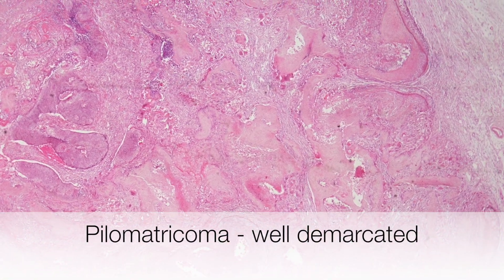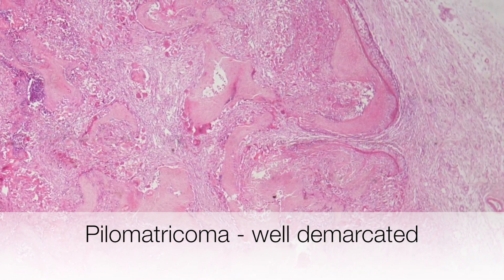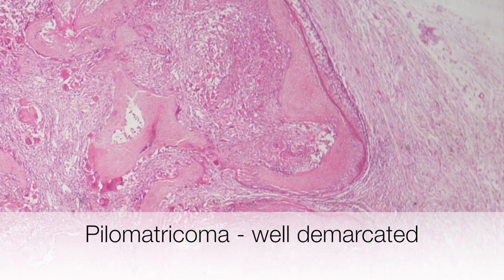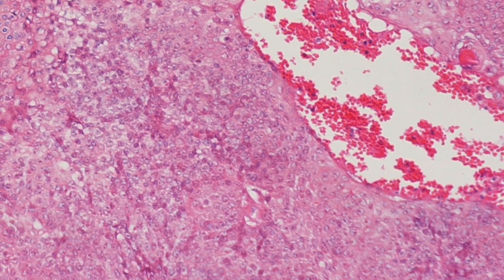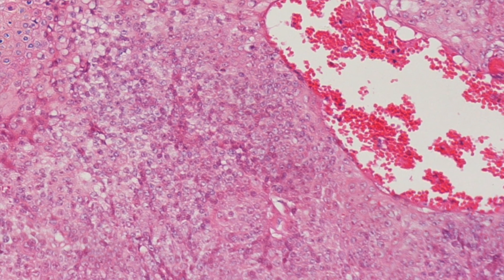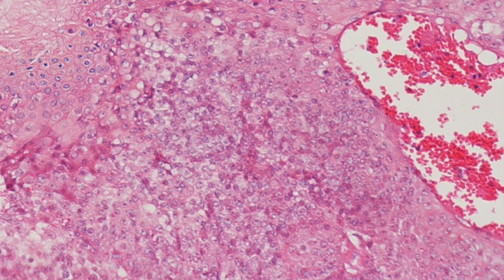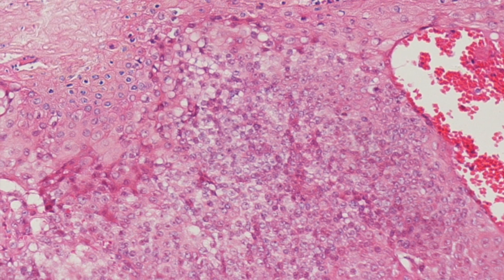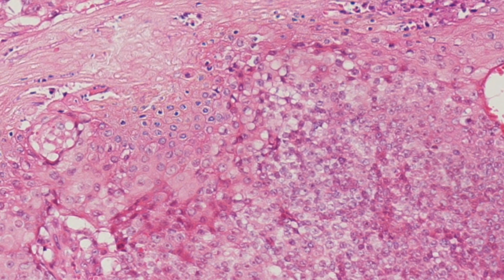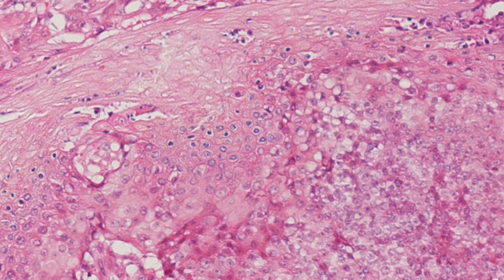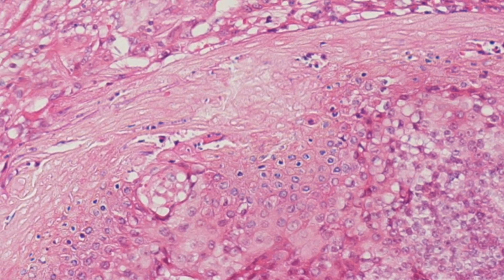On low power, you can appreciate that the border of the pilometrichoma is well demarcated as we move into the connective tissue at the right side of the picture. These blue staining cells are basaloid cells, and as we move along towards the left, you can see that the basaloid cells start to lose their nuclei. Eventually, the cells are completely devoid of nuclei and these are ghost cells or shadow cells.